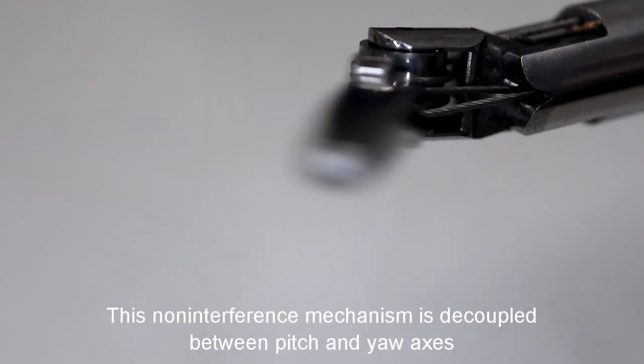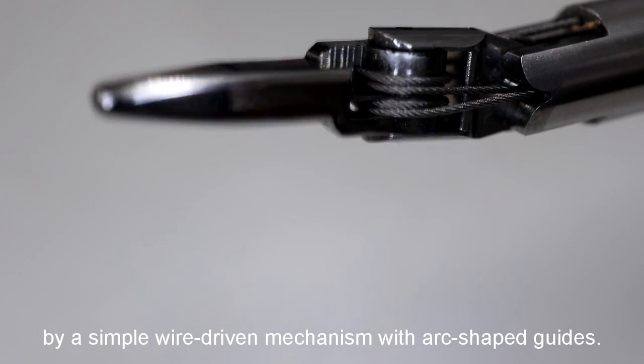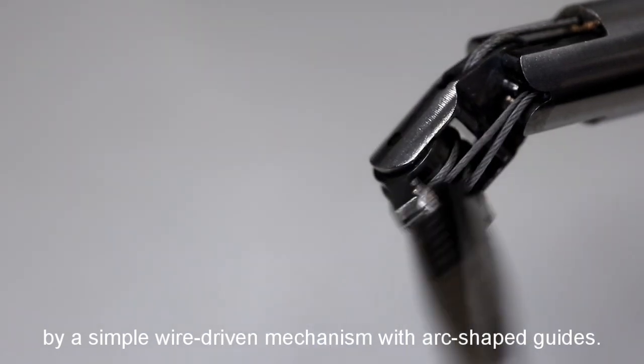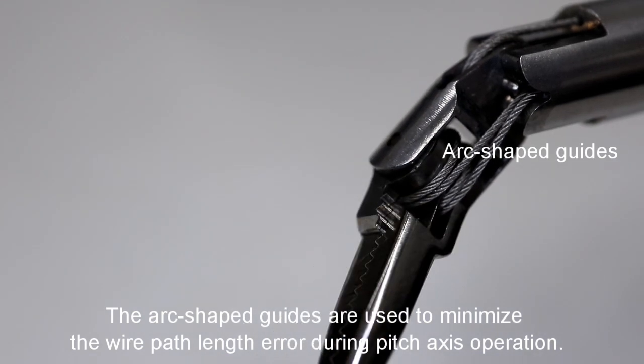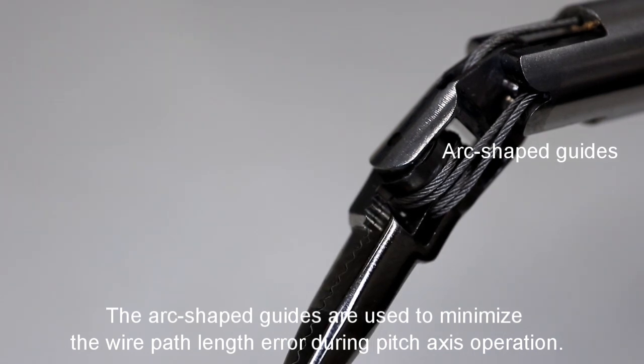This non-interference mechanism is decoupled between pitch and yaw axis by a simple wire-driven mechanism with arc-shaped guides. The arc-shaped guides are used to minimize the wire path length error during pitch axis operation.